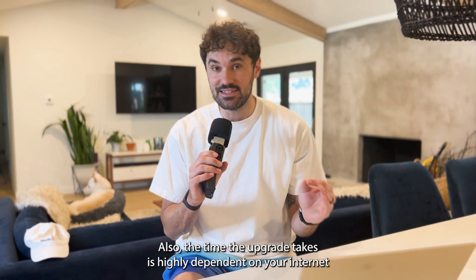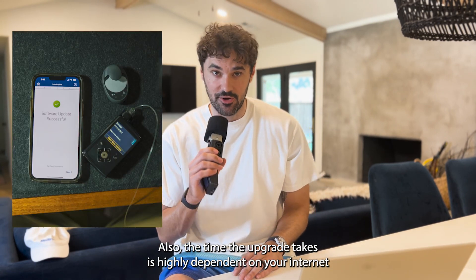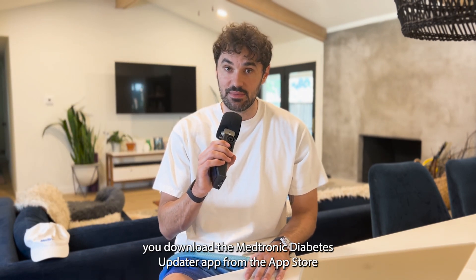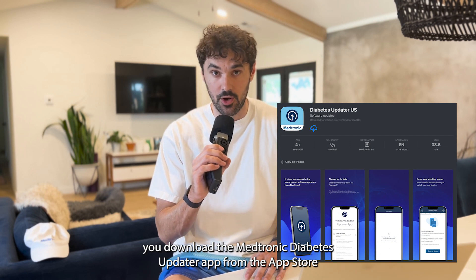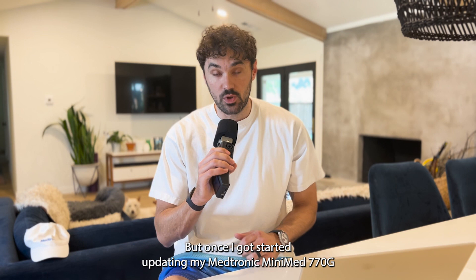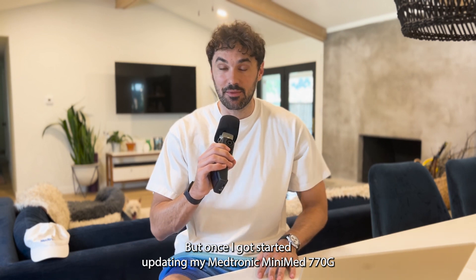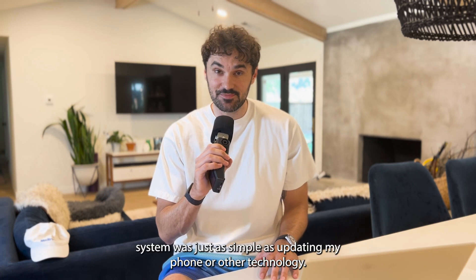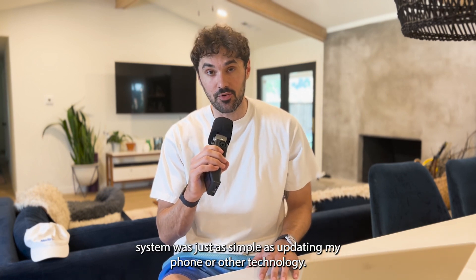The time the upgrade takes is highly dependent on your internet speed. The upgrade process can take up to two hours and requires you to download the Medtronic Diabetes Updater app from the App Store. So give yourself some time and space to get the upgrade done. But once I got started, updating my Medtronic MiniMed 770G to the Medtronic MiniMed 780G system was just as simple as updating my phone or other technology.